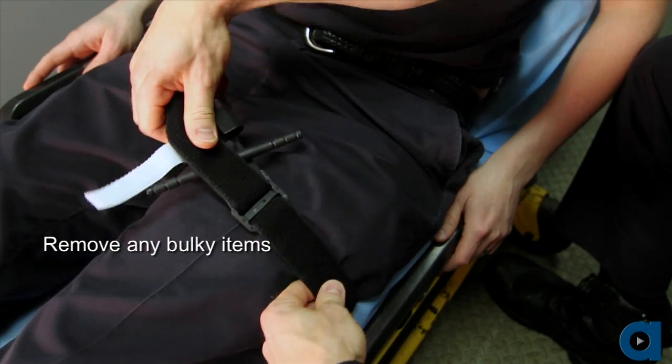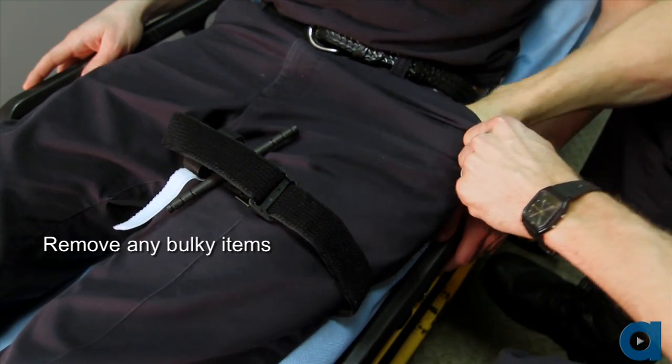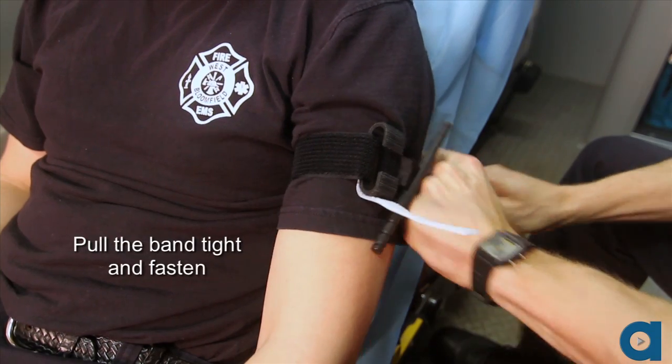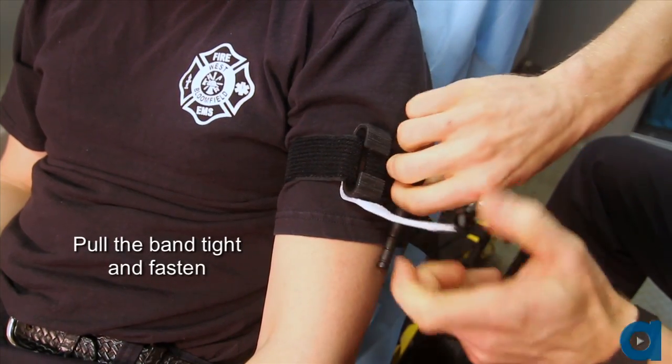When applying the tourniquet to a leg, ensure that bulky items are removed from the pocket prior to fastening the band. Pull the securing band tight and fasten the band back onto itself.